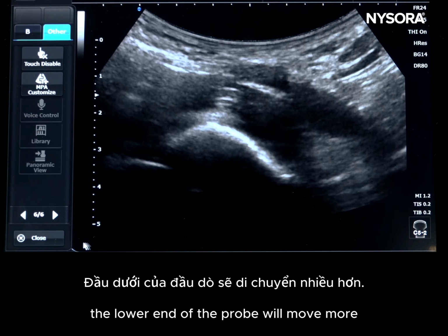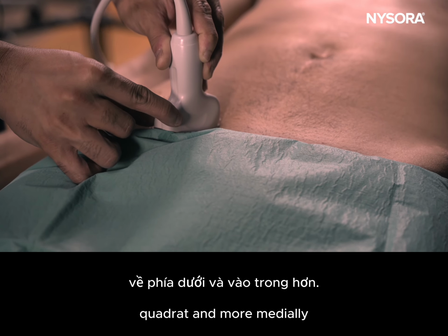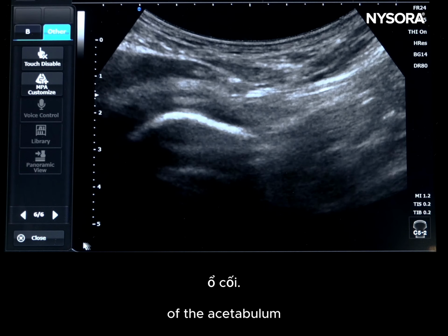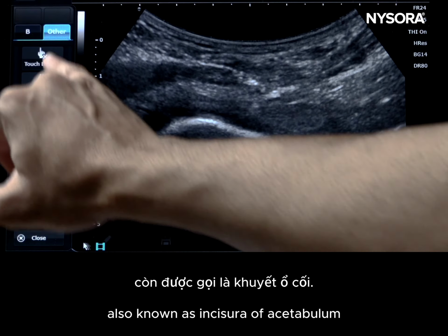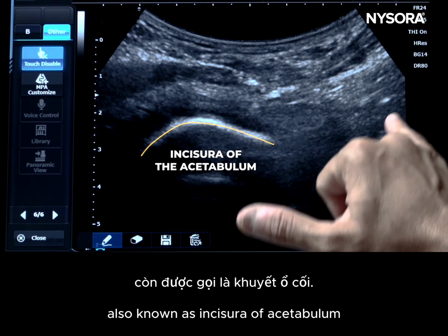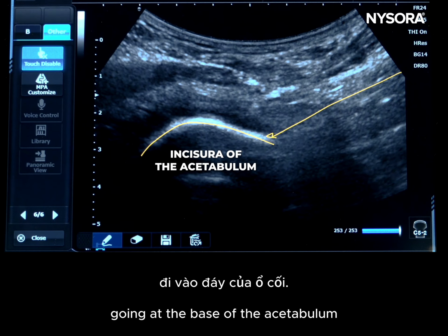The lower end of the probe will move more caudad and more medially, and that will show you the inferior aspect of the acetabulum. And here we have the inferior aspect of the acetabulum, also known as the incisura of the acetabulum, and you will be bringing the needle in plane going to the base of the acetabulum.